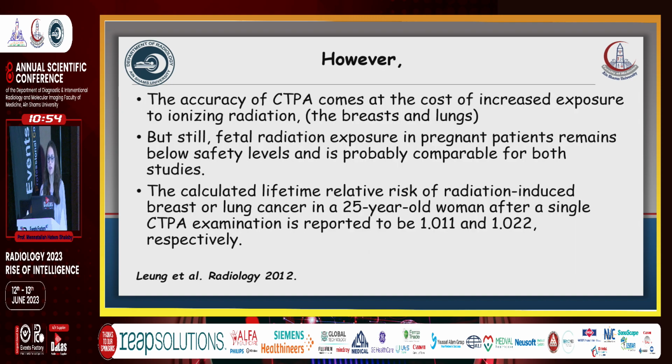However, the accuracy of CT pulmonary angio comes at the cost of increased exposure to ionizing radiation, especially to the breasts and the lung. But still, fetal radiation exposure in pregnant patients remains below safety level and is probably comparable for both studies.